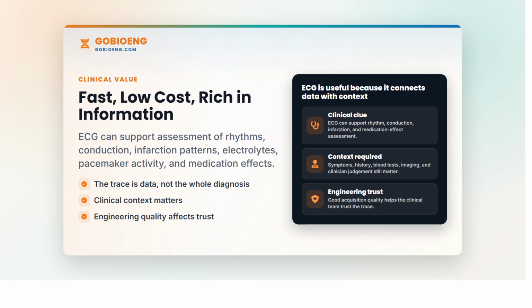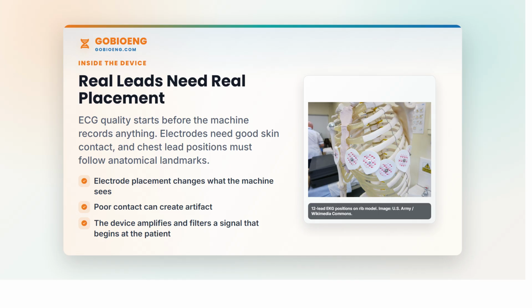This brings us to artifacts. A good ECG engineer respects artifacts. Baseline wander can come from breathing or electrode movement. Muscle tremor can add high-frequency noise. Loose electrodes can create dramatic false patterns. Wrong lead placement can mislead interpretation. Mains interference can appear as regular electrical noise. When an ECG looks strange, ask two questions. Could this be physiology? And could this be acquisition? Good engineering helps clinicians trust the answer.